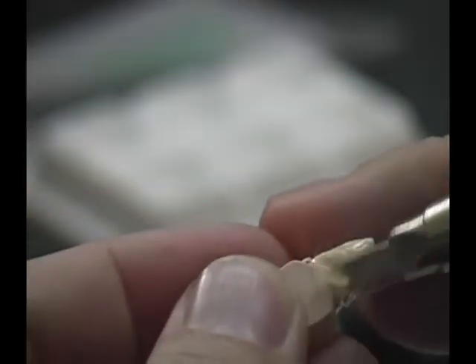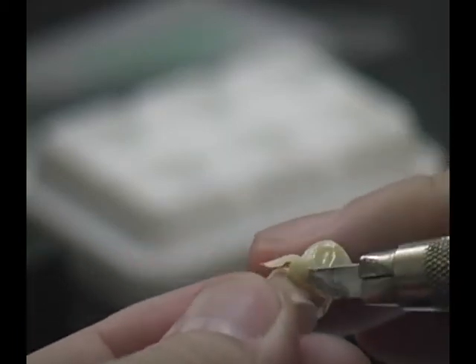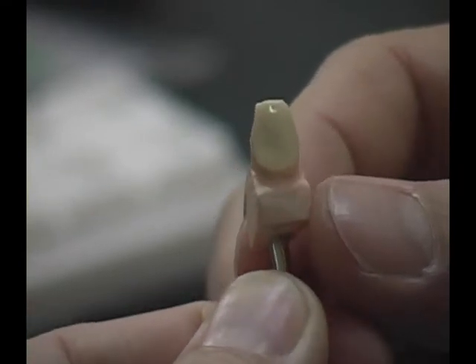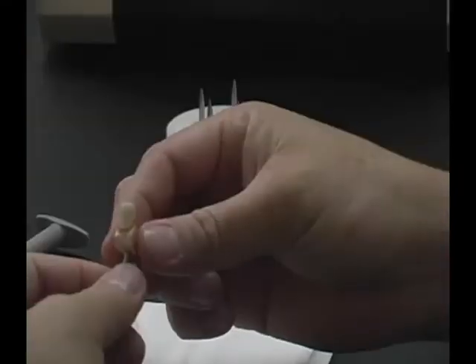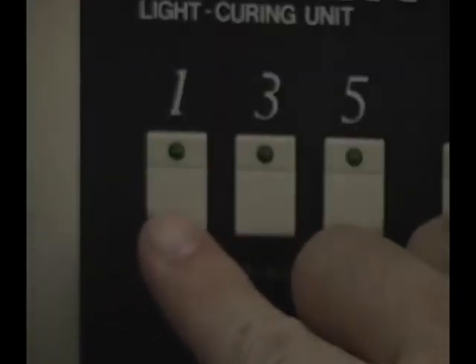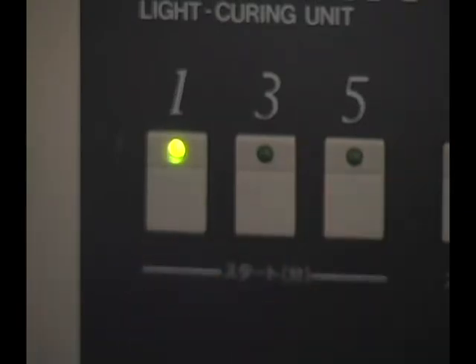Remove the excess from the margin area using a cutting knife. The first application of dentine is complete. Place the die on the tray and select button number one on the curing unit to light cure for one minute.